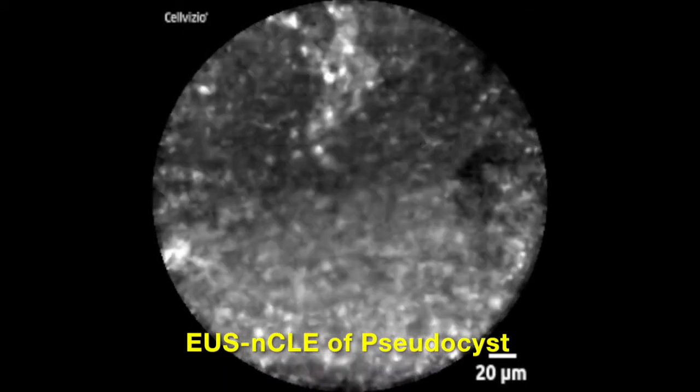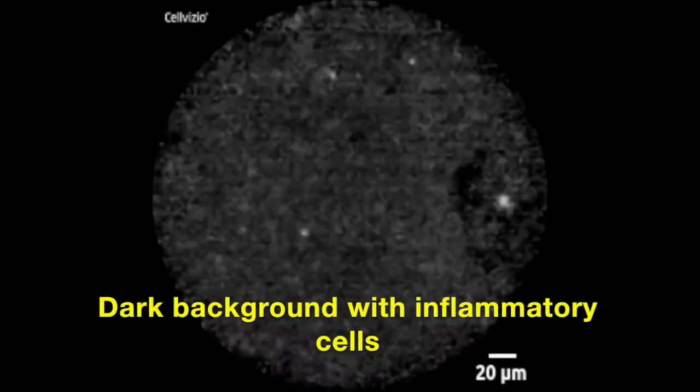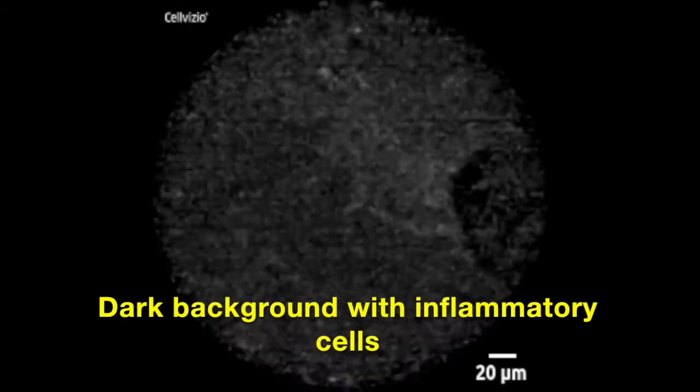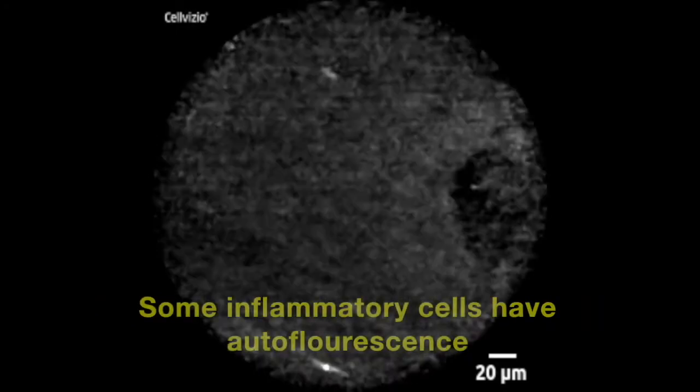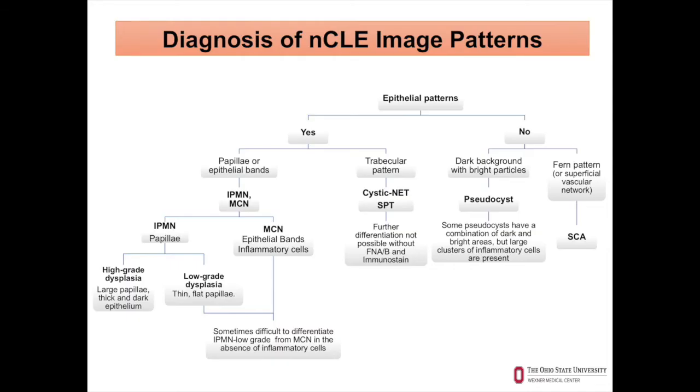In this last example, you see a very poor uptake of fluorescein with lack of blood vessels, and the background is featureless and dark with some autofluorescent inflammatory cells. Now that you have a good idea about these image patterns, we will quickly recap.